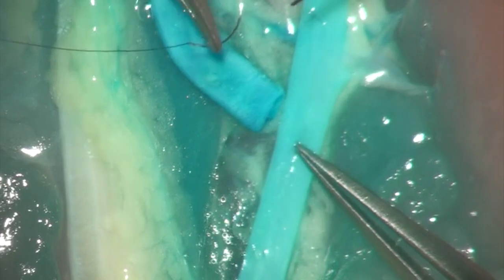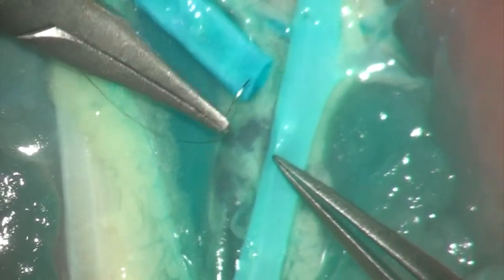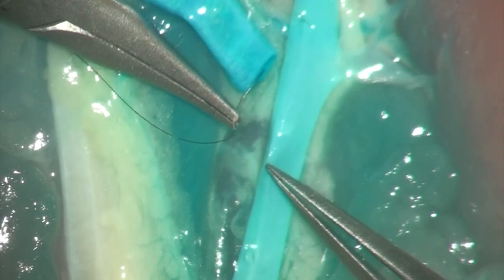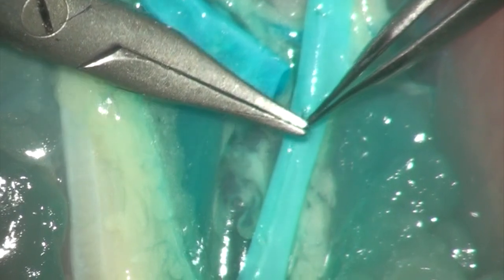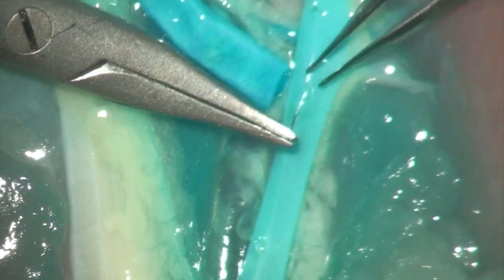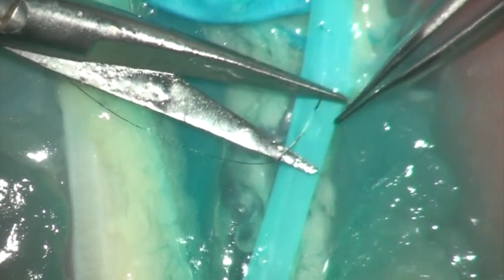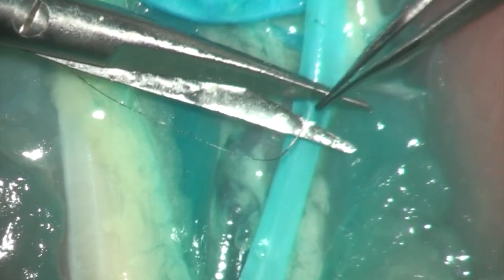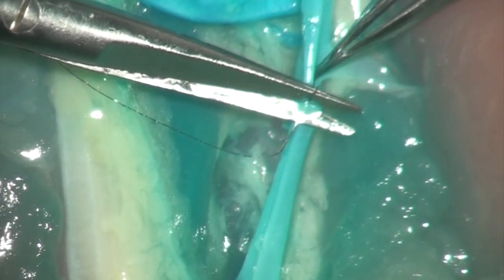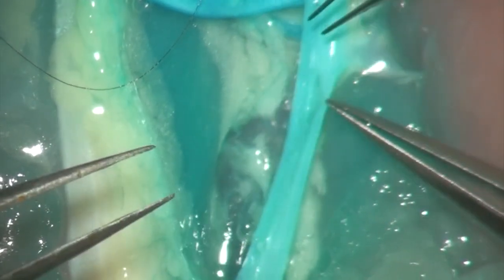The first step is to create the arterial window in the recipient vessel. One easy way to do this is the needle method, which has been described in previous videos. A bite is taken in the recipient vessel equivalent to 2/3 the diameter of the donor vessel. You then use the micro scissors to make the window perpendicular to the needle. This method ensures that the arterial window is created efficiently and of appropriate size.